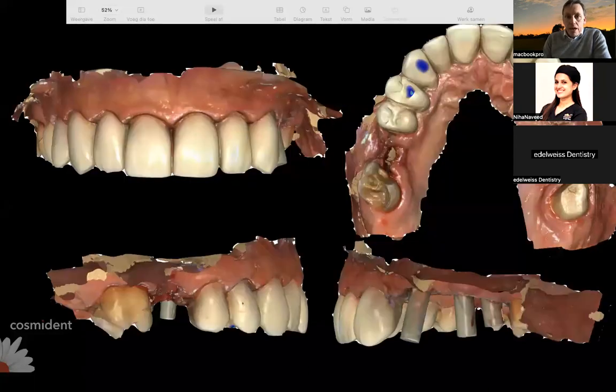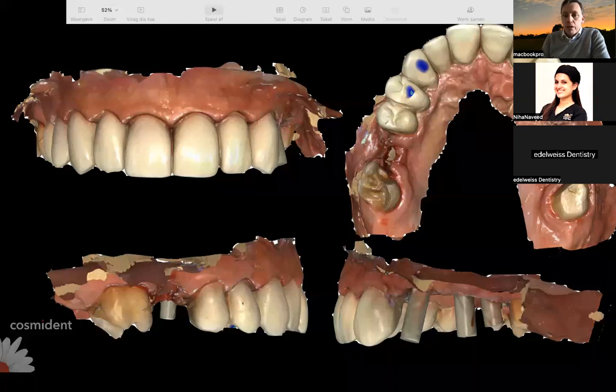Finally, after placement of the implants, we did an intraoral scanning with the scan flex, because the patient was there. That's what you have to understand: we did a 1-day treatment. The patient is there in the office, still waiting to get his crowns, because for the moment we go to the laboratory and produce the definitive crowns.